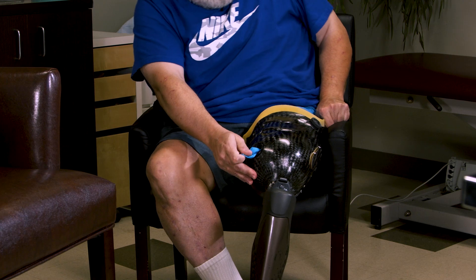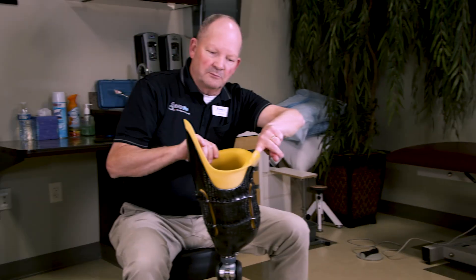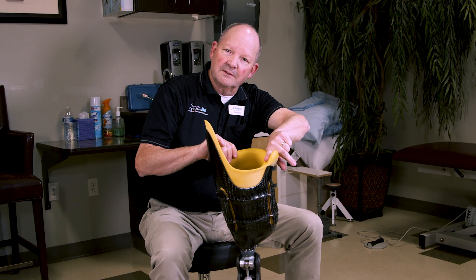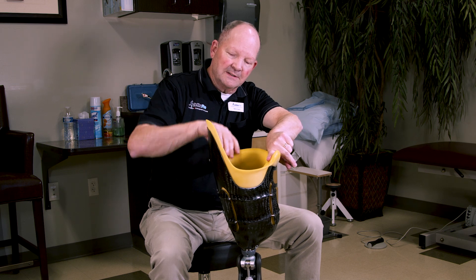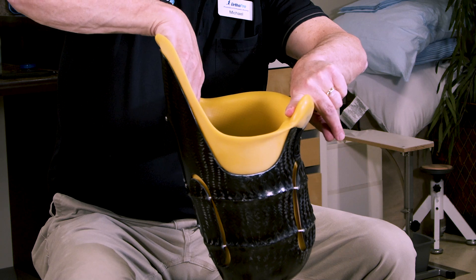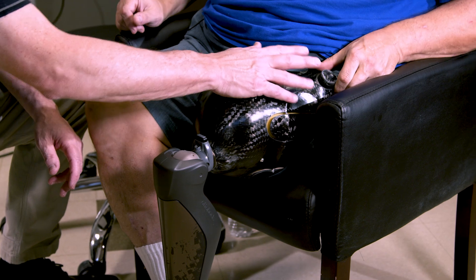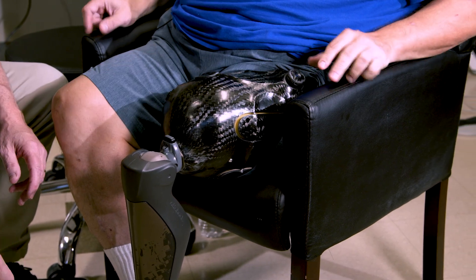One of the best features of this kind of design is how it captures the ramus of the pelvis, the bone up inside the pelvis, and it locks between there and the hip and stabilizes the socket so it walks very well. It also has extra padding on the inside. It's a very comfortable design even though it's directly against the patient's skin, and it maintains the suspension of the prosthesis very well.